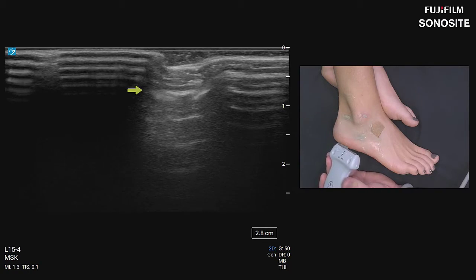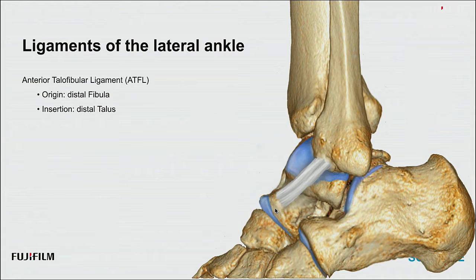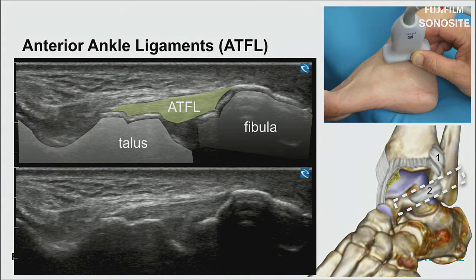Now the ankle ligaments. The ATFL originates at the distal fibula and inserts on the distal talus at a prominent tubercle. We fan the ultrasound beam over the cartilage until we see that tubercle—that's where the ligament inserts almost 100% of the time. The probe is in a slightly oblique orientation. Plant on the fibula and windshield wiper the distal portion of the probe to find it.